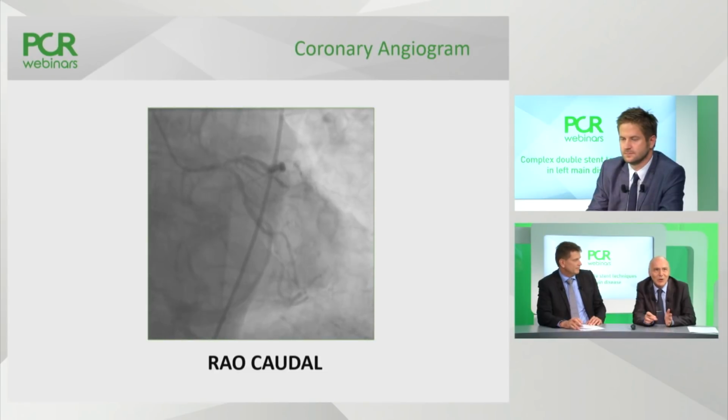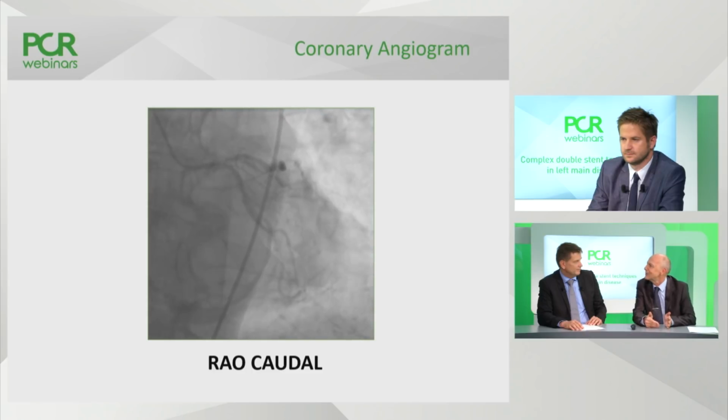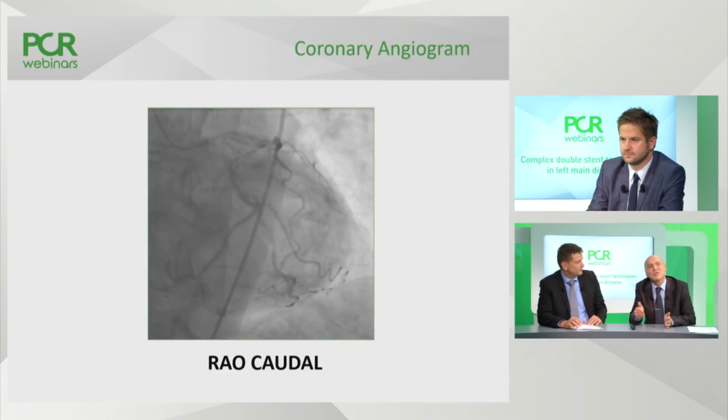I thought, okay, I have to fix left main circ. We have diffuse disease in the left main and the tight LAD. And I also considered the fact which you mentioned, that the circ is dominant. I knew that after placing the left main LAD stent, the circ would look worse. I expected it not to be closed, but I expected that I would have to stent it.